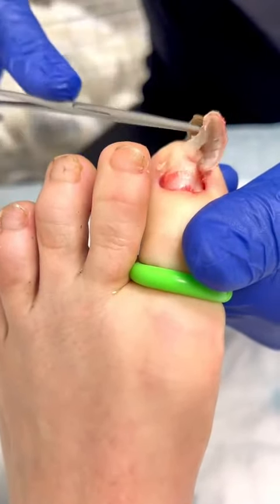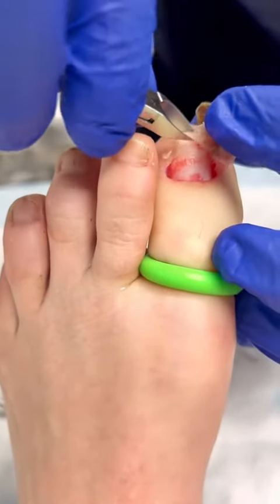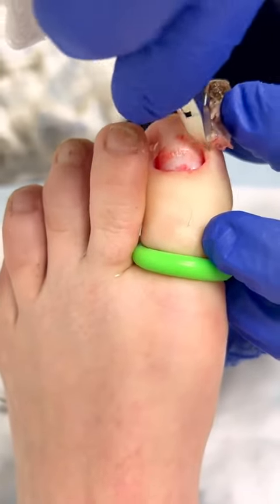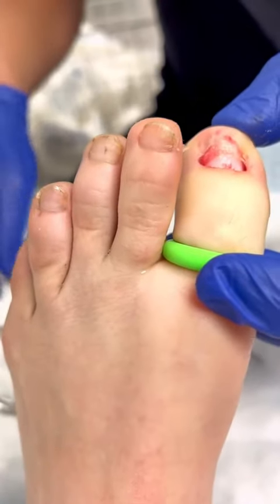We grab the hemostat, come in with our little tissue nipper, and we just cut that little piece of skin that's always attached. And there you have it — completely gone. Nail's free.